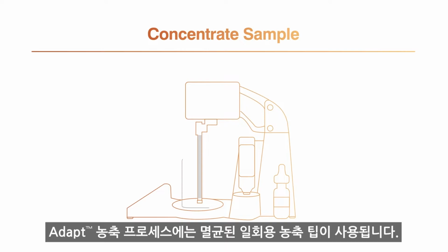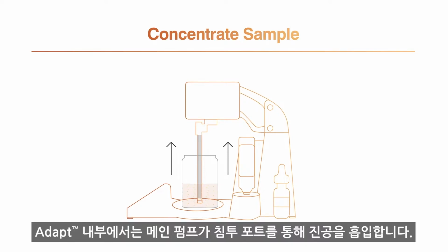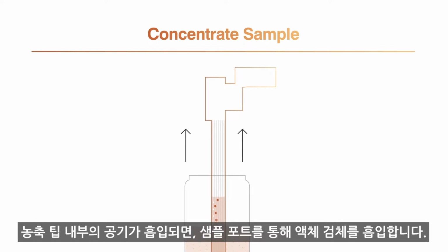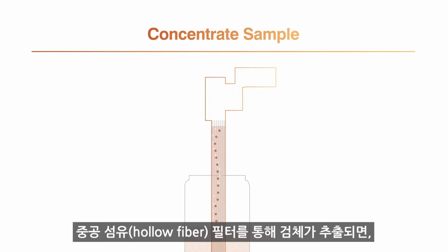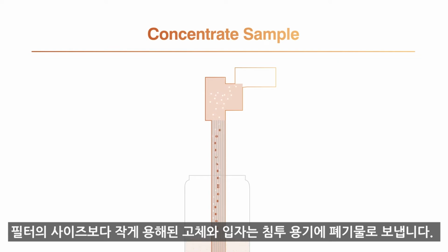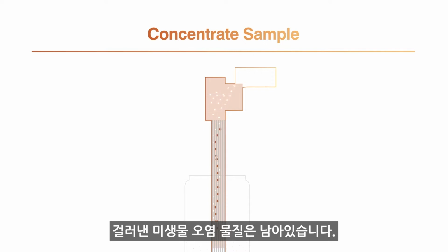The concentration process of the Celsis Adapt utilizes sterile, single-use concentrating tips. Inside the Celsis Adapt, the main pump draws a vacuum through the permeate port. The air inside the concentrating tip is drawn out, and the liquid sample is pulled up through the sample port. As the sample is drawn through the hollow fiber filter, particles larger than the membrane filter's pore size are captured. Meanwhile, excess liquid, dissolved solids, and particles smaller than the filter's pore size pass through into the permeate container as waste. Captured microbial contaminants are left behind.